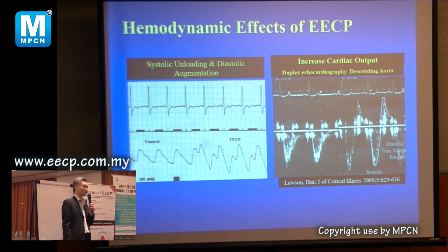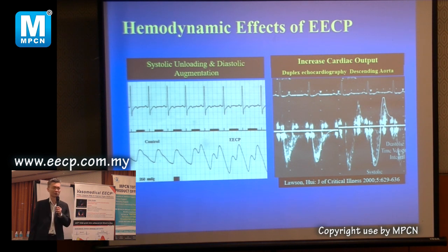But from the leg, I think within 1 week you cannot do it, because the wound, the scab, the clot is not so stable. You go and squeeze, you can burst it and cause an aneurysm. So minimum 1 week to 2 weeks. 1 month will be safer, then you cannot be blamed because the wound has already healed. But within 1 week, if you burst it, then it's your fault because you create this massive pressure.